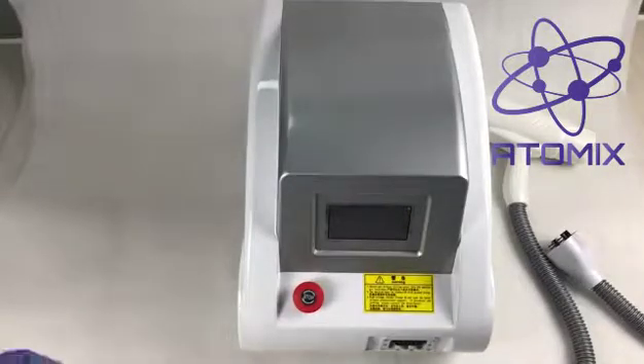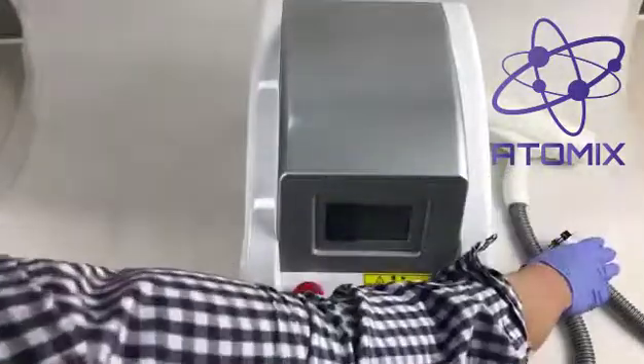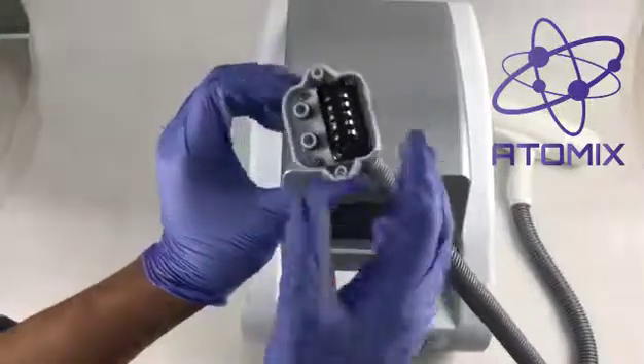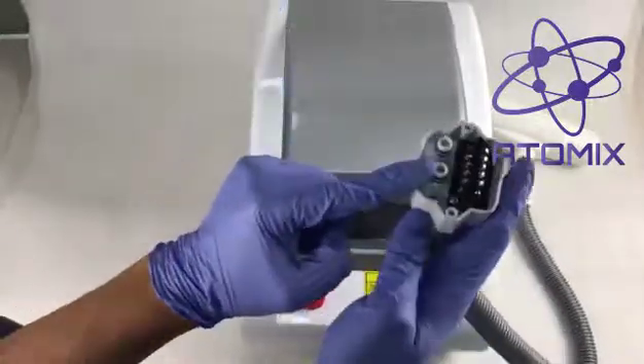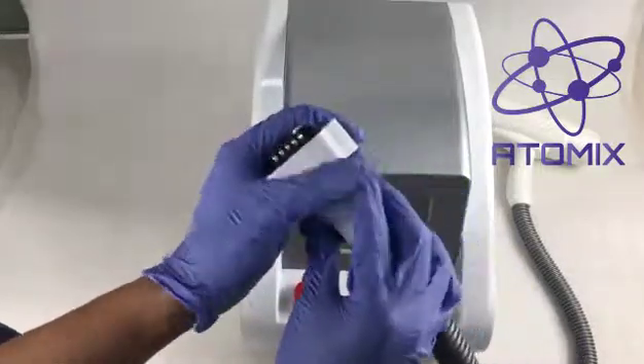So first, we're going to go over the steps of installing this laser. You probably want to have this handle installed first, because we're going to fill it with water, and the water will go through this tubing. It's very essential to have this handle installed first.